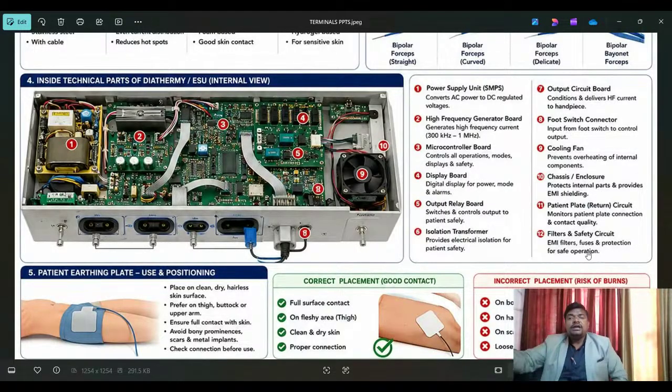So sometimes low quality machines, and also low quality accessories and spare parts that are not compatible, do not give reliable service. Okay, you are a technical person. We accept that you did the service and replaced the spare part, and it is working fine. But after 1 or 2 days or 1 week, the same problem comes back again. Then what will happen? If you did the work right, then the spare part is not of good quality. That's why many problems can come up in practical life.